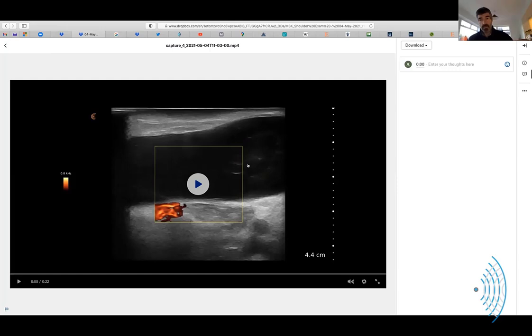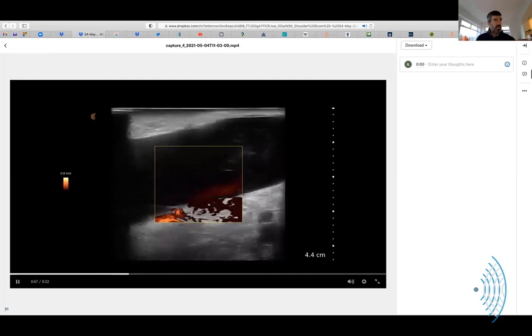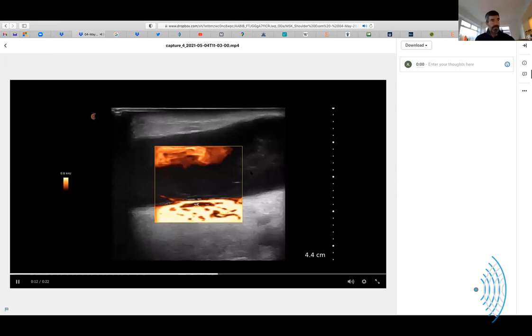You can't quite quarter one of these things. You'd have to have the box on big and only pick up larger vessels. But in the area of interest, increase the sensitivity, shrink the box down if necessary to get the machine to work faster and with more sensitivity, and then really look at those areas. You'd be making sure of some of the more solid looking bits. Okay, that's what I was wanting to know. The area of interest would then not necessarily be the edges. The area of interest would be where it is dense.